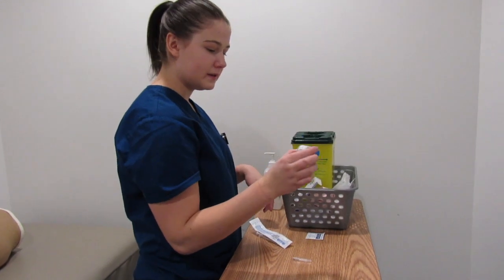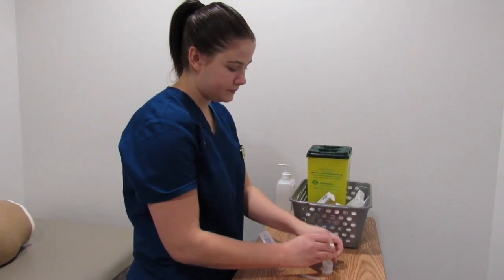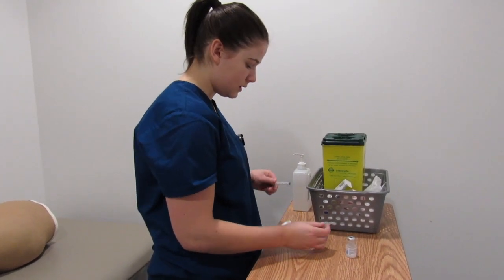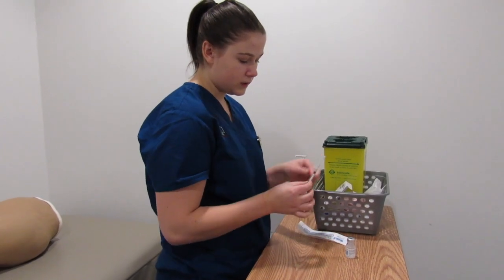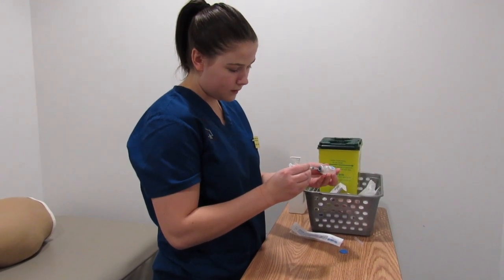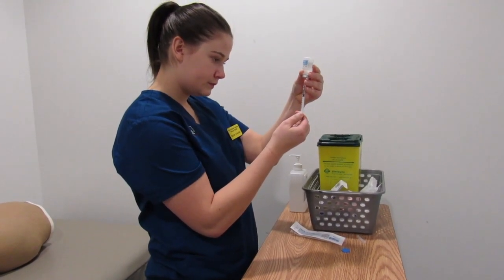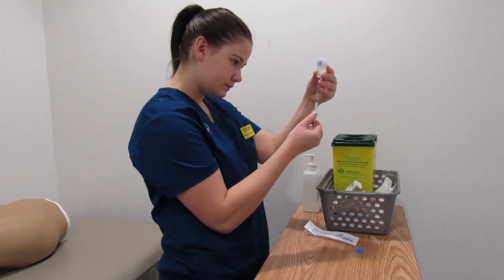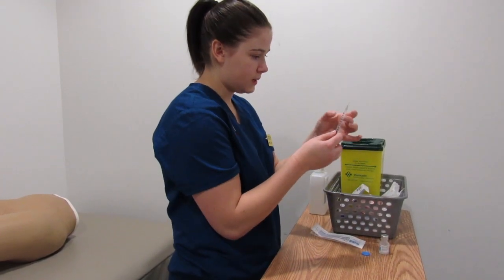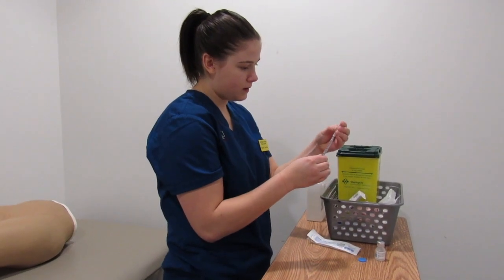So I've grabbed a 1 mil vial of the heparin. I'm going to take the cap off and just sanitize the top of the vial. Dispose of that. I then have my needle and my syringe, and I'm going to attach the needle to the syringe. I'm going to remove the cap, not the needle, and I'm going to draw up 1 mil. Once I've done that, I'm just going to make sure I get all the air bubbles out, and place the cap back on the needle.